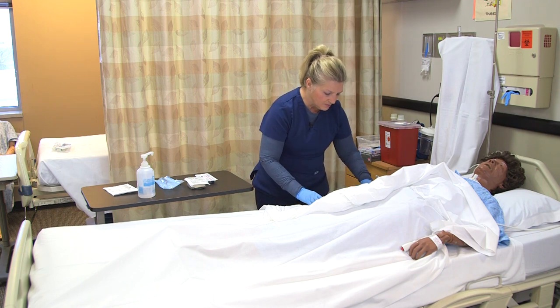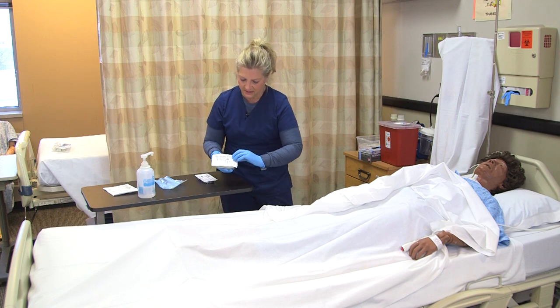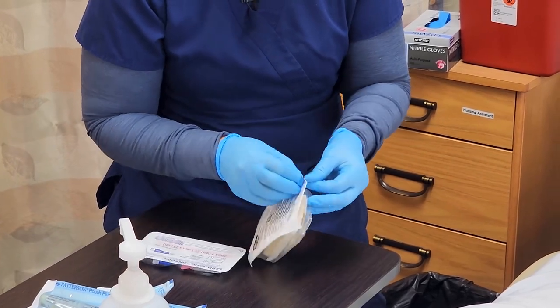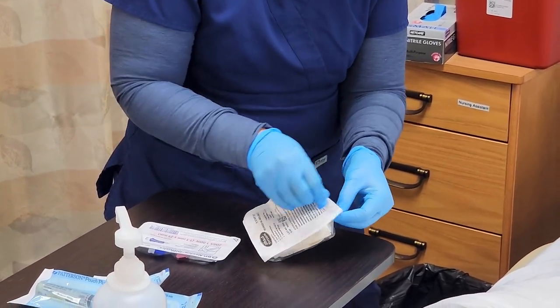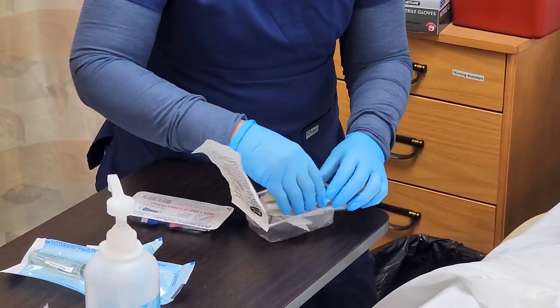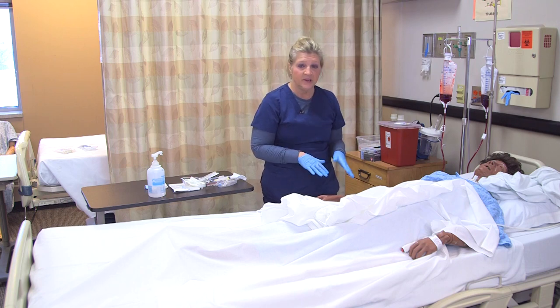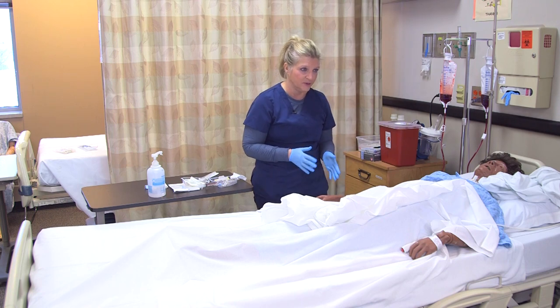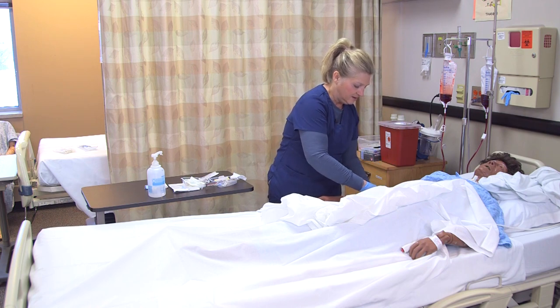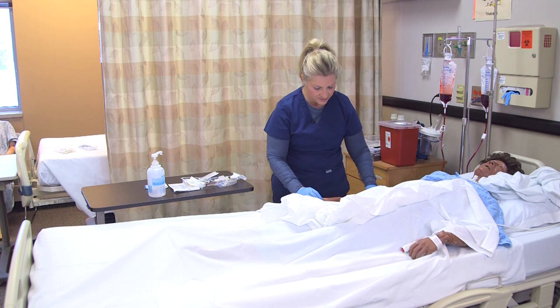I'm going to grab the tourniquet from my IV start kit to assess the veins and find the appropriate vein to use for this patient. I'll place the tourniquet on and then examine the veins.